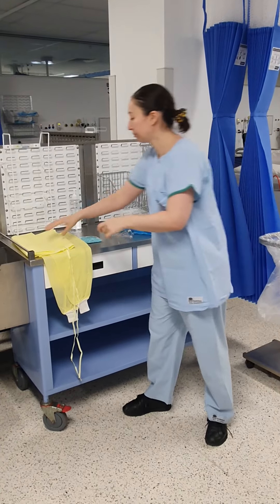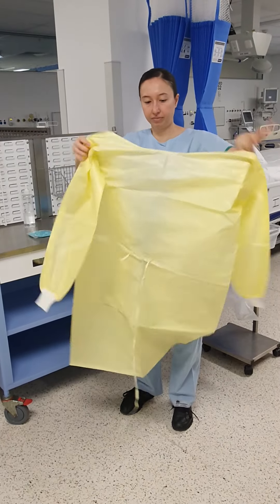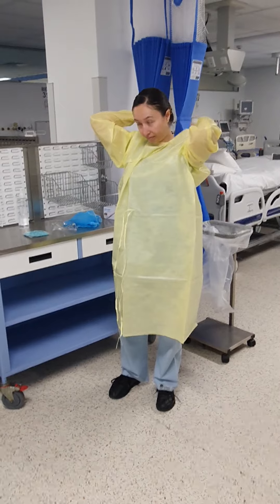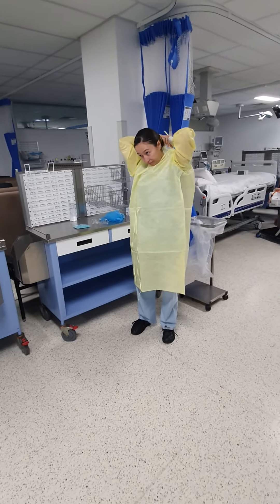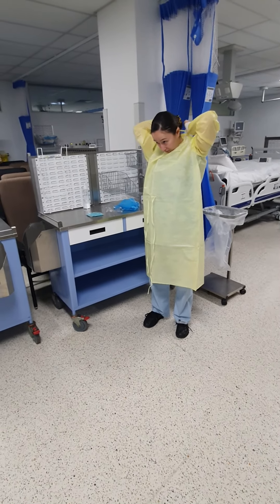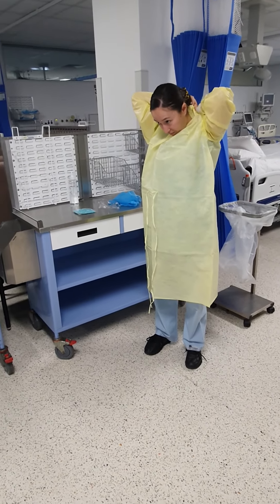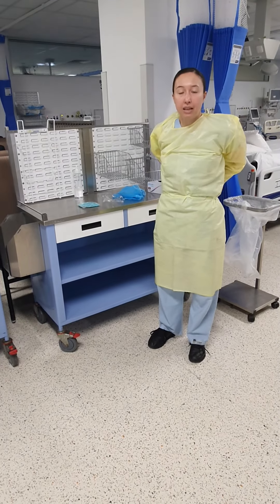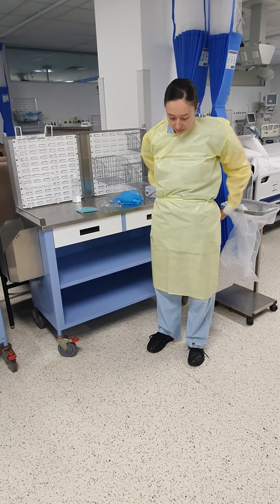Then you don on a gown. Make sure you tie the gown at the back, not at the front.